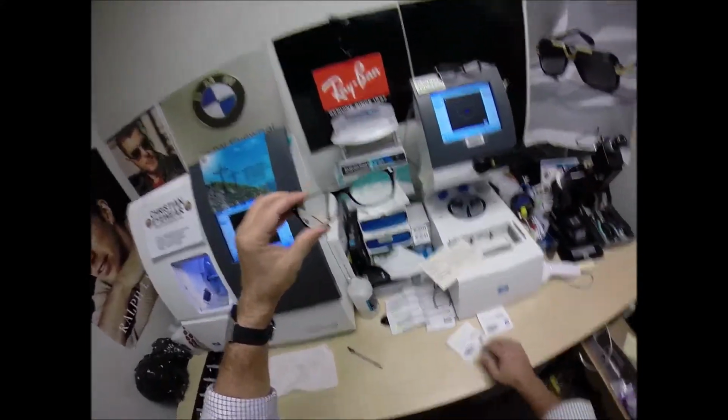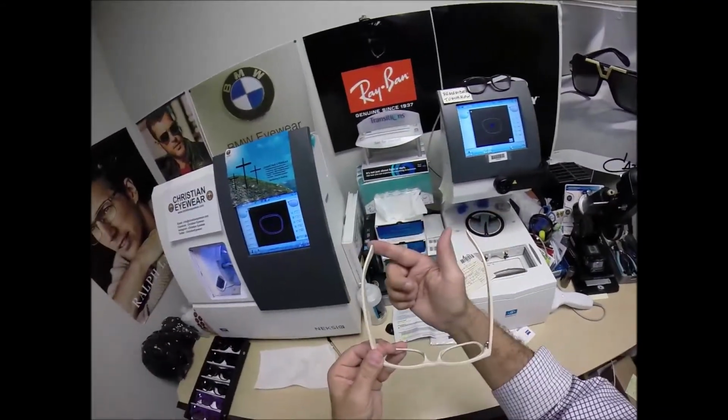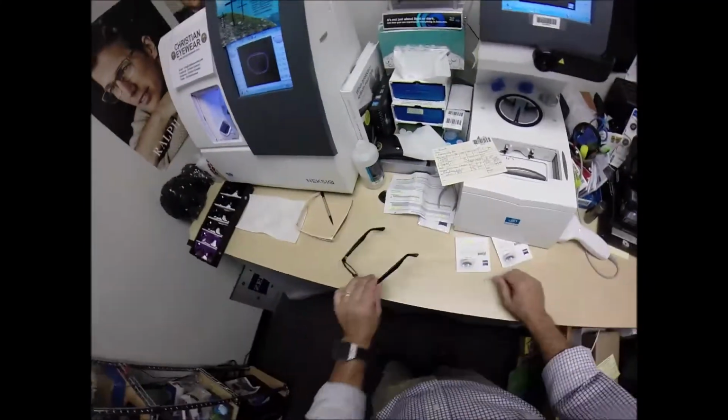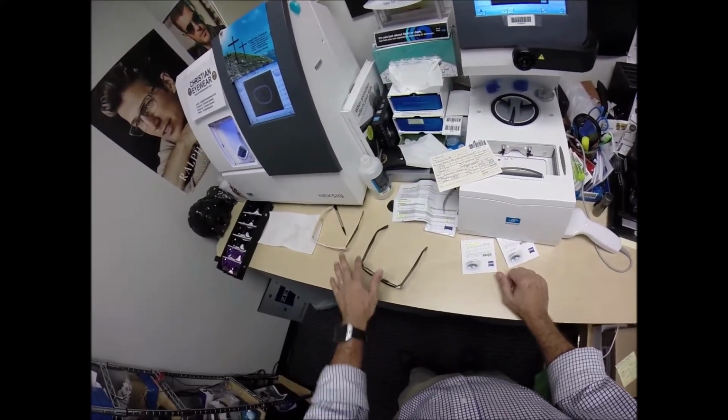But I'm going to get these in standard alignment first, also known as a 3-point stance. The 3 points are 1, 2, and the bottom of the frame being 3. I set them on the counter and press down. There is no wobble. Now, when I say wobble, when I take mine off and press down, they wobble on the counter, but they sit level on me.